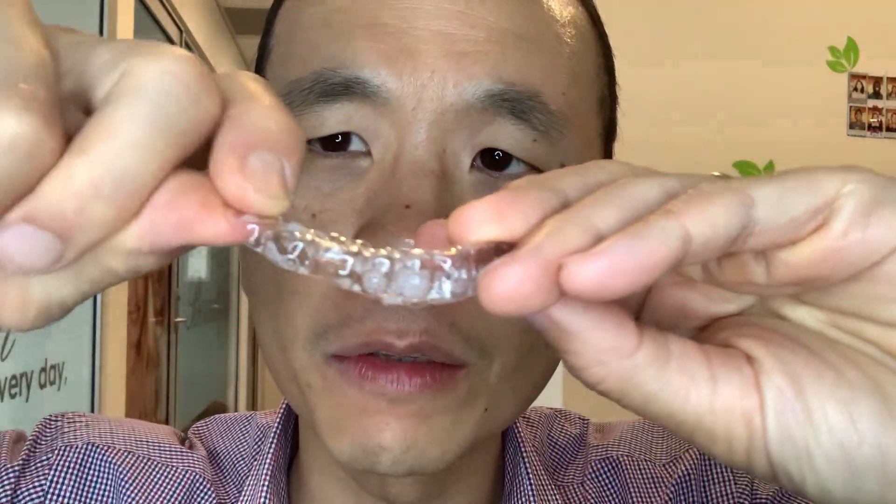What you really want to do is when you take your retainers out, take it out from the back first, and then the other side, and then from the front. Sometimes when you take it off at the back you need to use two fingers — one from the outside and one from the inside — and lift on the back part of the retainer.